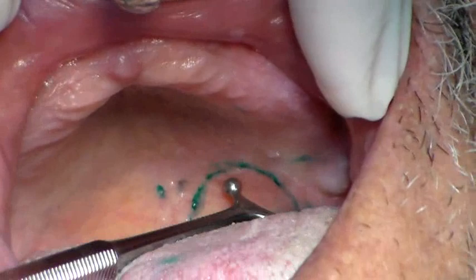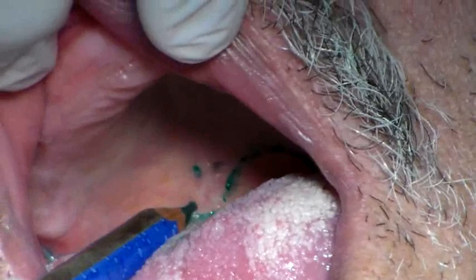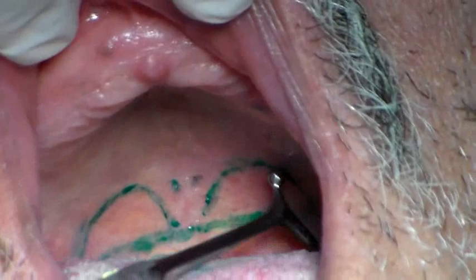From the midline going to the side, this area is compressible, but further forward it is not. The reason I am not marking the center — which is also slightly compressible — is because that is the mid-palatal region and we have the posterior nasal spine there. I do not want to put pressure into that region at all. This line is the anterior vibrating line.